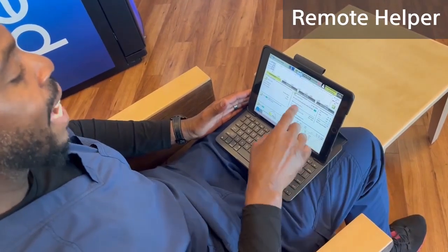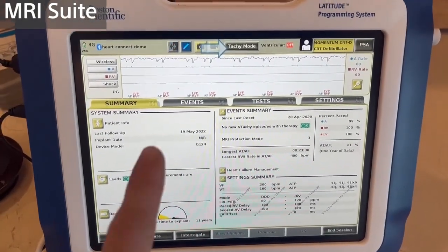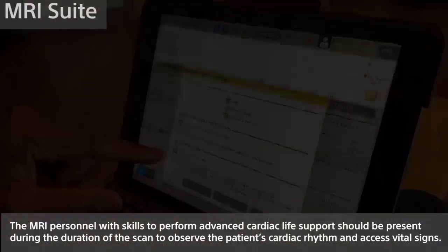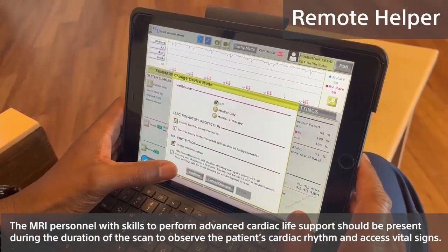What we're going to do is go to the Tachy Mode button at the top of the screen located right there. Next, we're going to go to MRI Protection Mode and enable MRI protection right here. Next, we're going to hit the Continue button.